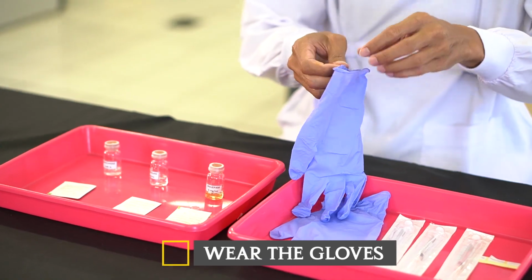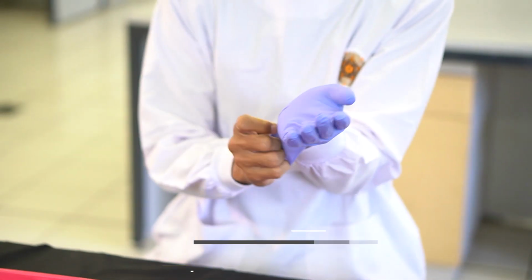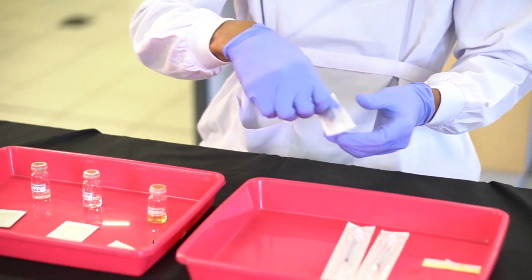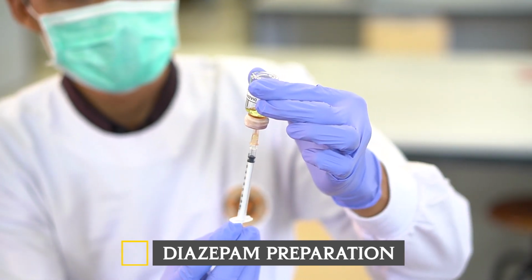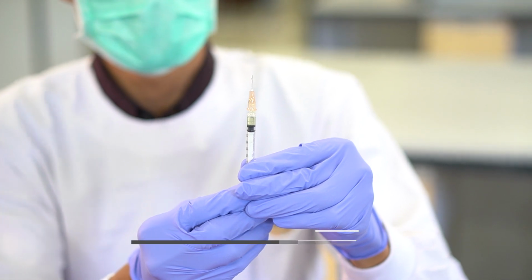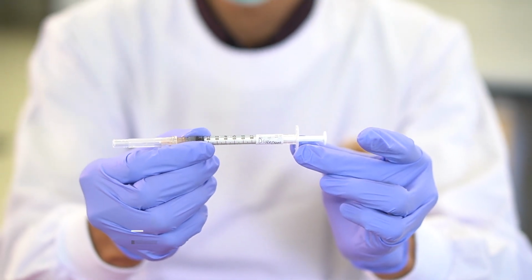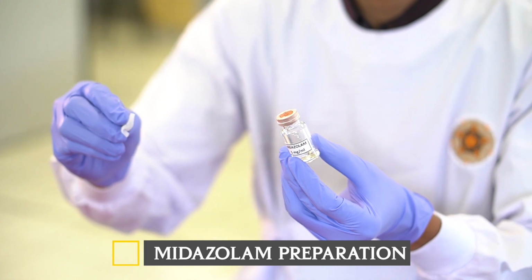Wear the gloves. Diazepam preparation. Take 0.04 milliliters of diazepam. Midazolam preparation.